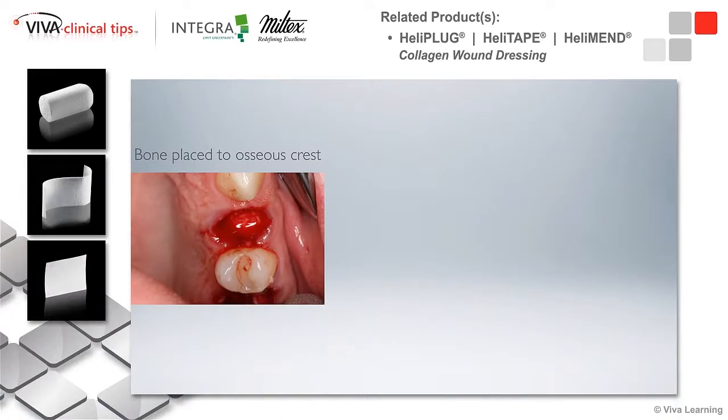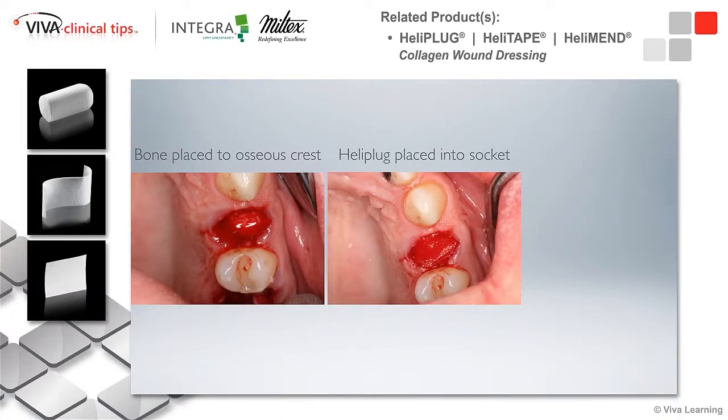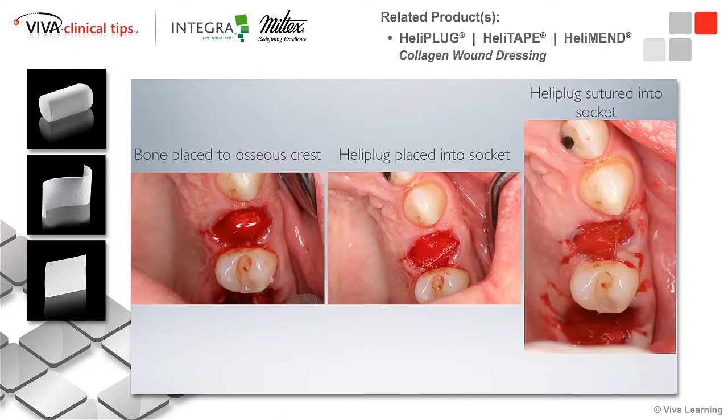We've placed our bone. Now we've placed our HeliPLUG into the socket. And then finally we've closed over the socket with sutures, basically holding that HeliPLUG in place. That HeliPLUG is going to create a very strong blood clot, and it's going to basically stabilize this wound.